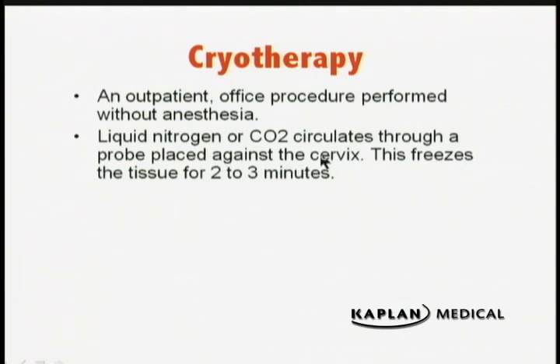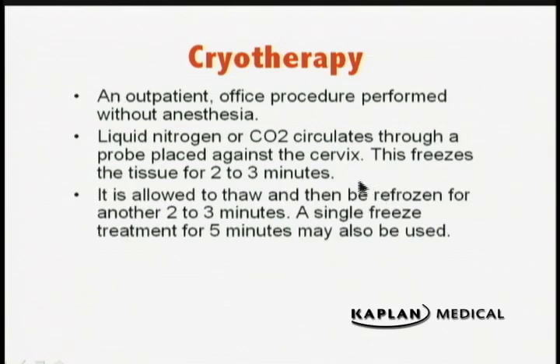I'll show you what that looks like. And it lowers the temperature of the probe to 100 degrees below zero. Very, very cold. This freezes the tissue for 2 to 3 minutes and creates what is called an ice ball. You can then thaw it and then refreeze it for another 2 to 3 minutes. Or you could use a single freeze for 5 minutes.